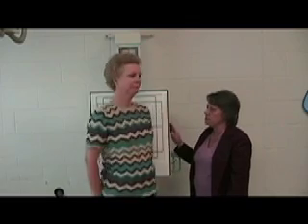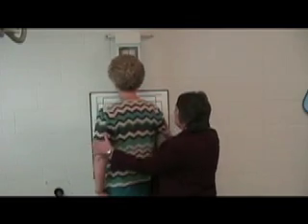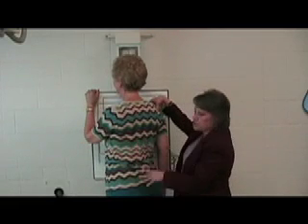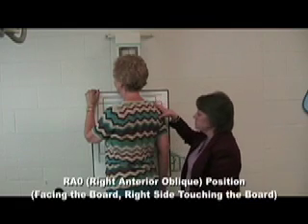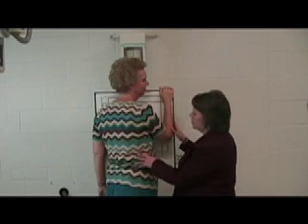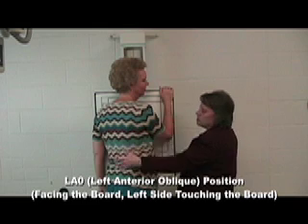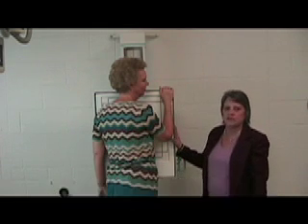Now we're going to angle you this way a little bit, with your right anterior portion of the body touching the board and the left posterior away from the board. So this is a right anterior oblique, or RAO, position. Now we've turned the patient so that the left anterior portion of her body is touching the board and the right is out away from the board. So this is a left anterior oblique, or LAO, position.